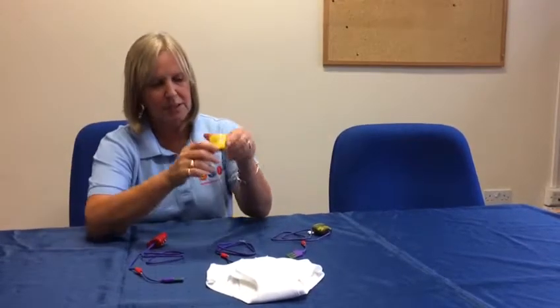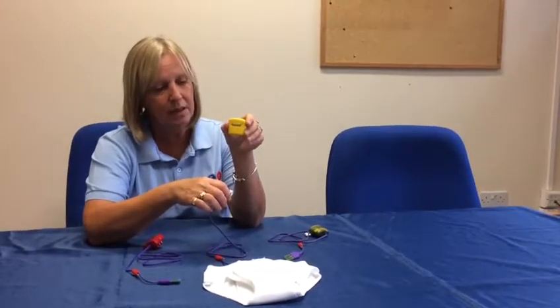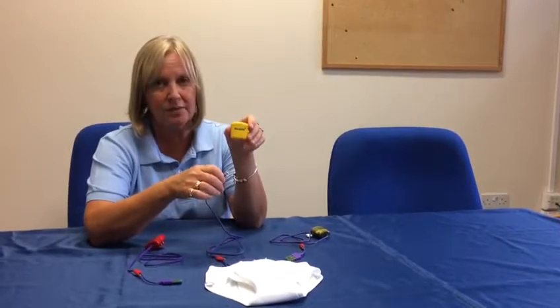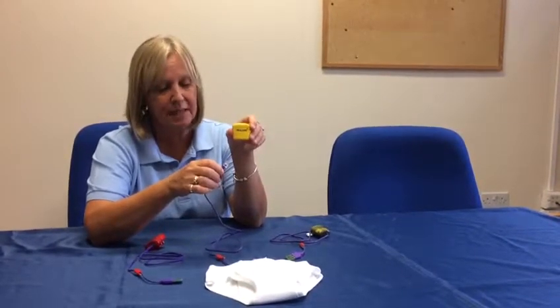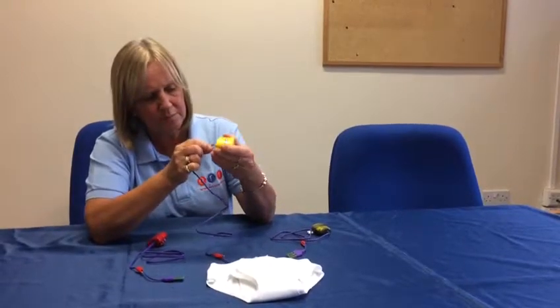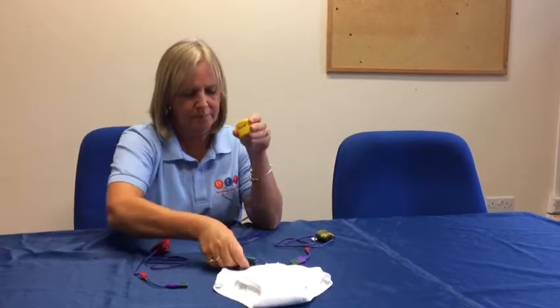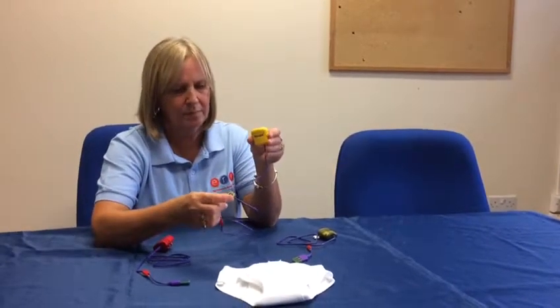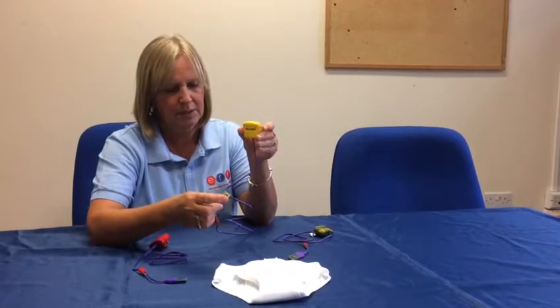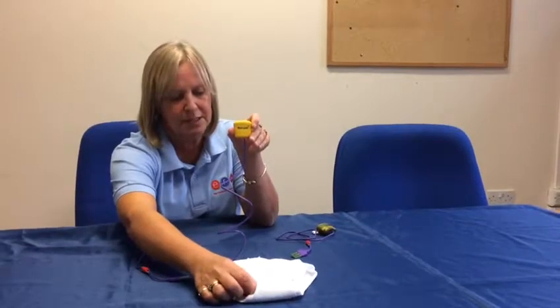The next alarm is the MO3 8. This is eight different sounds. This may benefit your child as your child may get used to one sound and not wake, so this plays a different sound every time. You plug the sensor in the bottom, and again you place the sensor in closely fitted pants.